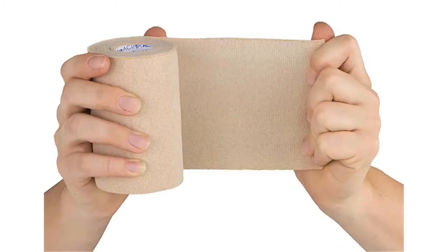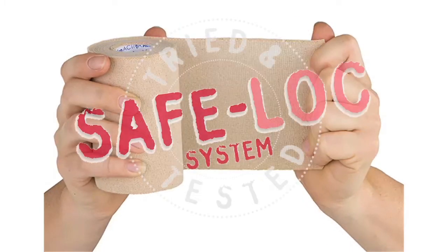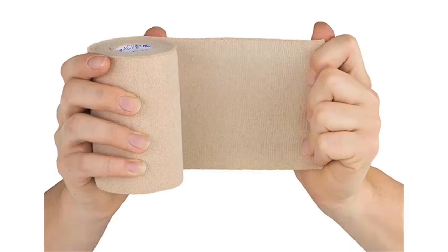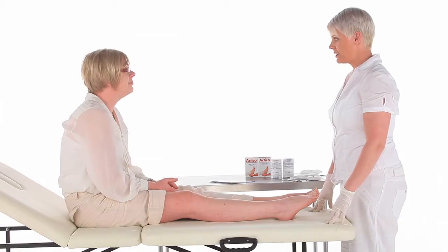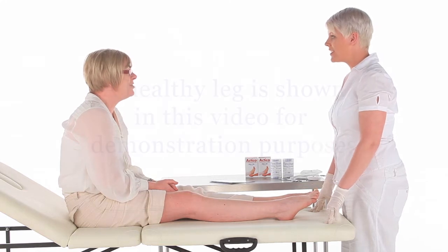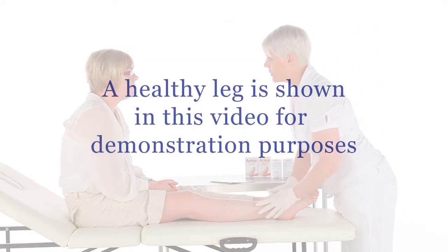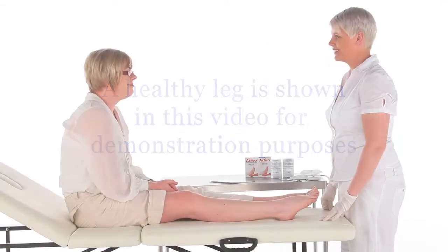The SafeLock system helps you deliver consistently safe, accurate and effective compression levels, and this video shows how to apply Actico cohesive inelastic compression for venous leg ulceration. Prior to applying any compression system, the patient should have a full holistic assessment in order that they receive appropriate compression therapy.